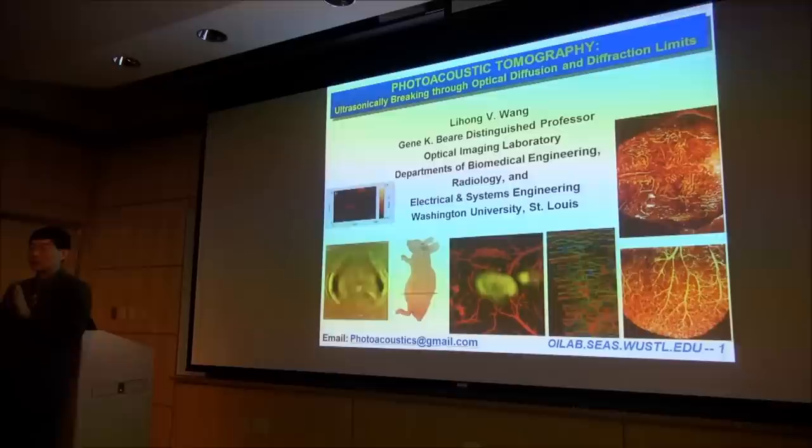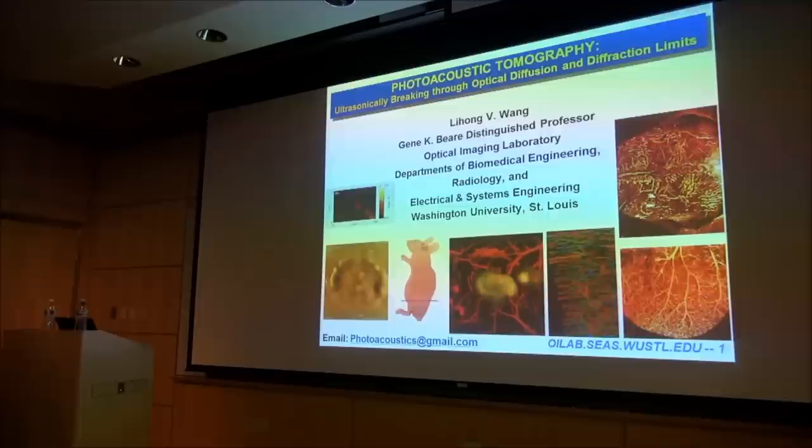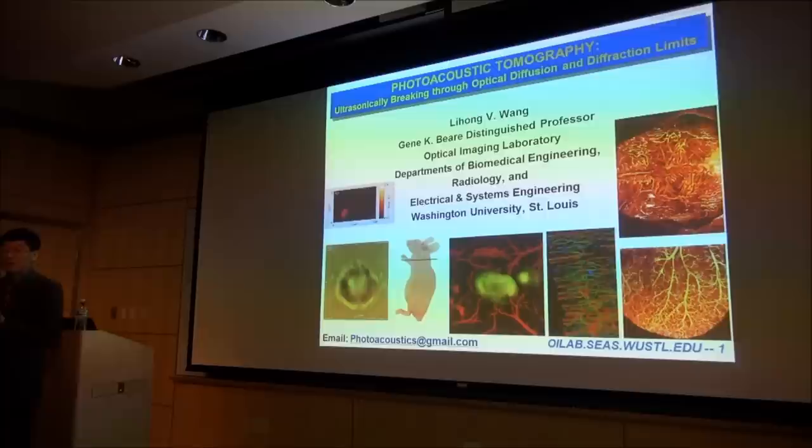Great question. So for microscopy, if you only want to penetrate, say, several millimeters, instead of using 5 or 10 megahertz, we use 50 or 100 megahertz. So you can afford to use high frequency and still penetrate ultrasonically. And that gives you, obviously, much better resolution in return.